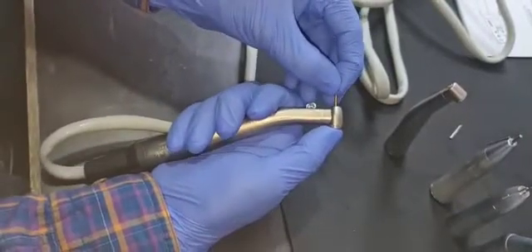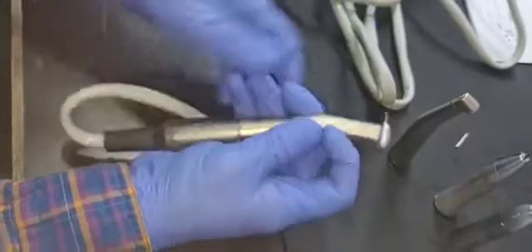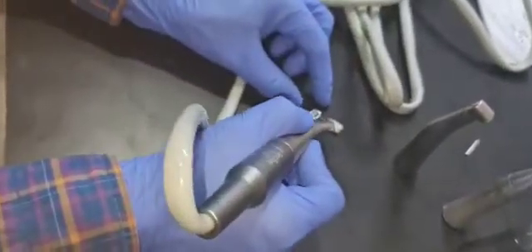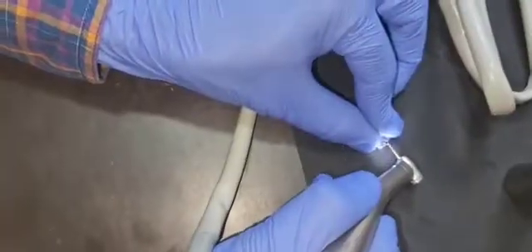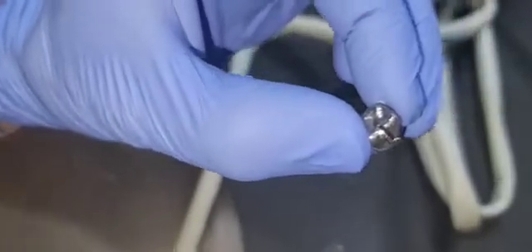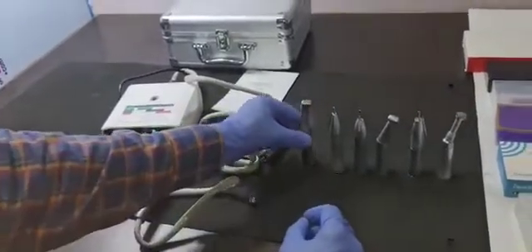I am using an air rotor metal cutting bur. You can see, I will show you how to cut this crown, metal crown. In a fraction of seconds, you can cut the crown easily. So I will show you now, one by one.